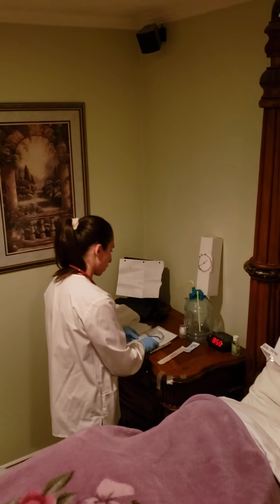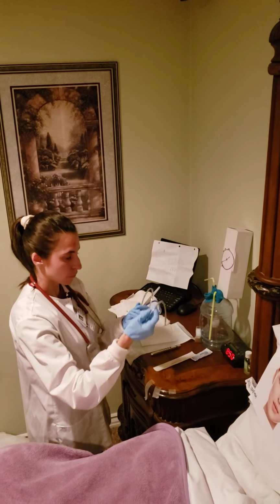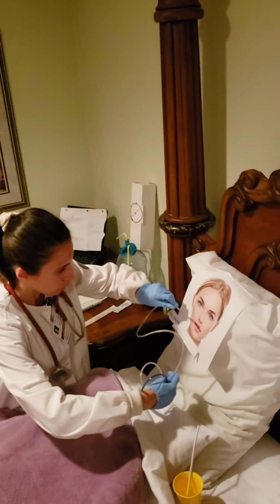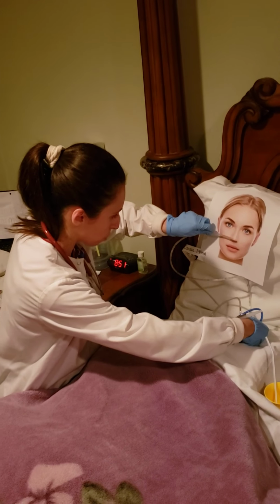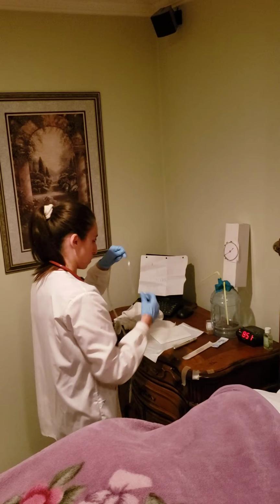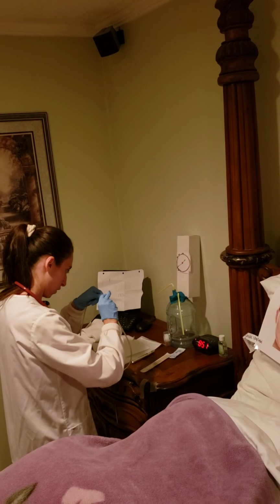And now I am going to measure the NG tube. So it's going to go from the nose to the ear to the xiphoid process. Okay, I'm going to place some tape on that.